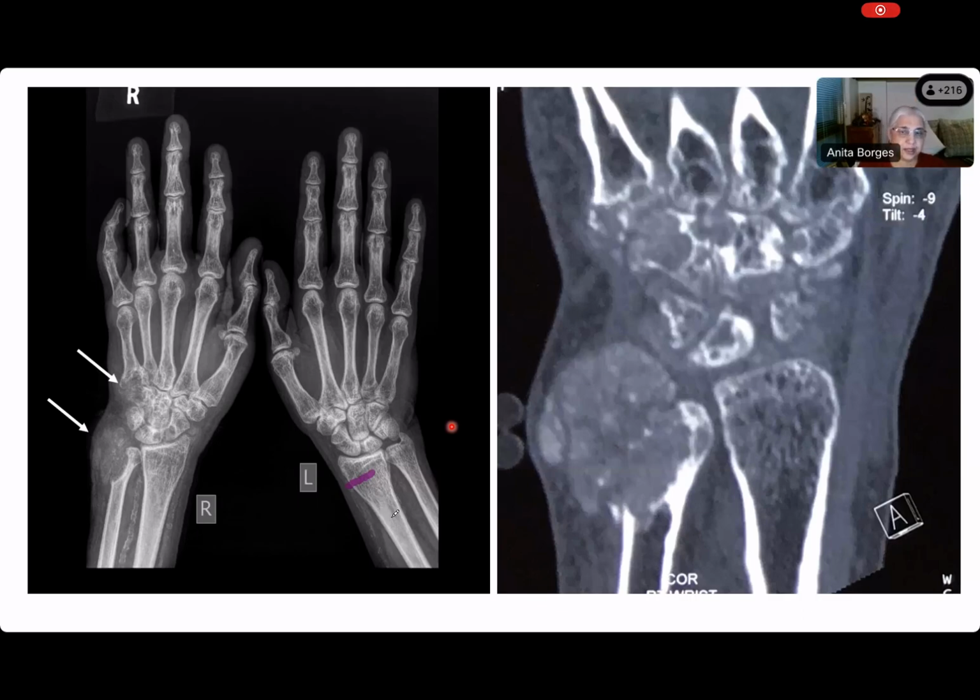Now you're seeing it as a white line, right, Mansi? Between your red vermilion and my red, you can see a white line. Everybody can see it. So if it had not been fused, what would that line have looked like? Translucent. Translucent to what, Mansi? Black. It would have looked black. Why? Because no mineralization. No, that's because it was cartilage, and cartilage allows X-rays to pass through it without any problem at all.